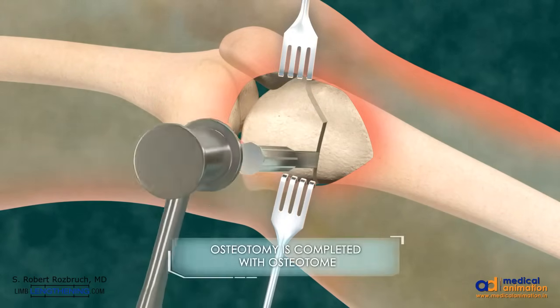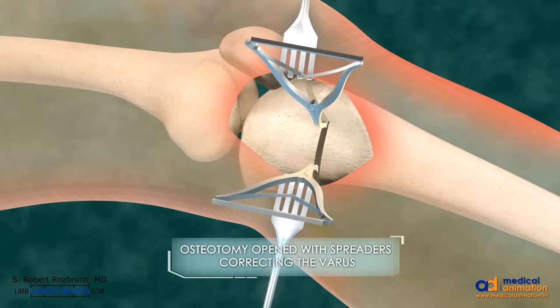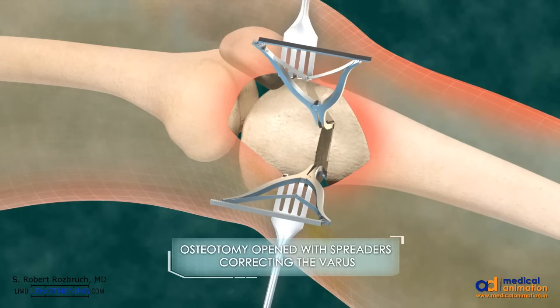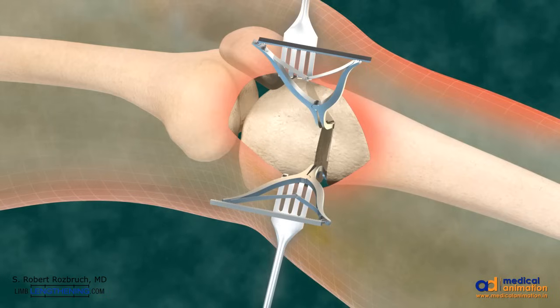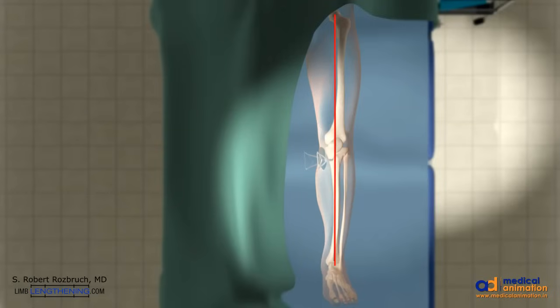An osteotome is used to further spread and complete the osteotomy, and laminar spreaders are used to open the osteotomy the precise amount to correct the deformity. This is all planned preoperatively based on radiographic planning and is confirmed intraoperatively in surgery.